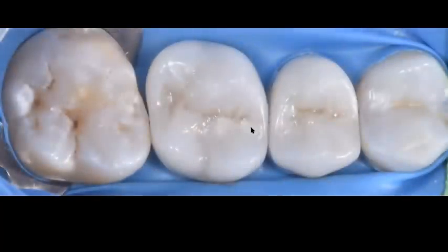Once you do that, I'm going to add the stain. And once I've added the stain to that little space that I created with my core packer, now I'm going to add very small increments, and in this particular case, because this is a zirconia, I'm going to use a dentin-like type of material. If this was an anterior tooth, or this was an Emax restoration, and there's a lot of enamel shade that has been used, then maybe I will use an enamel shade for my final layer.